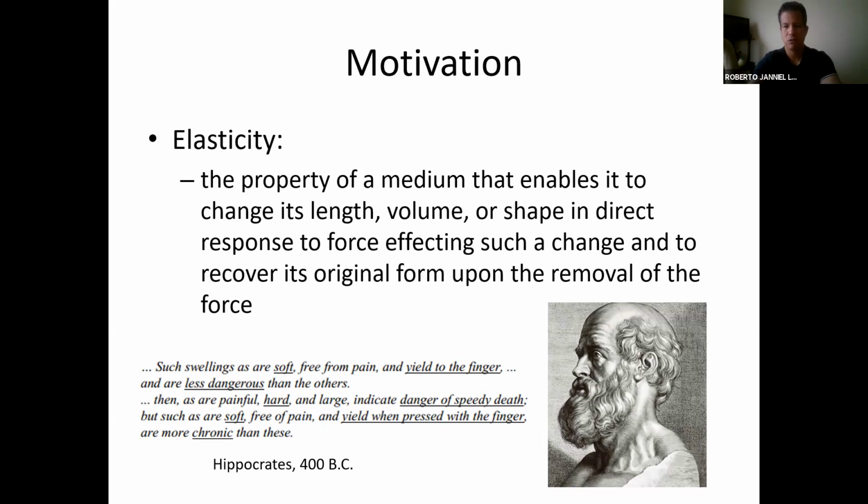Simply because it's some sort of a common sense thing, right? For prostate cancer, it would be the same thing eventually. So it's just, again, things to know and think about. So the idea is to do it non-invasively, right? If you can do this non-invasive palpation, which is the motto behind radiologic techniques in general, right? And that's what the field of elastography does.